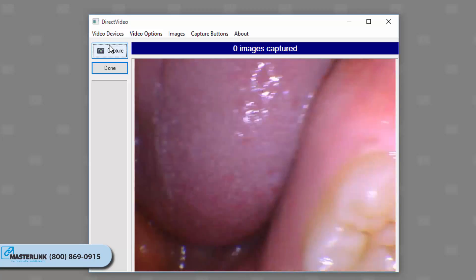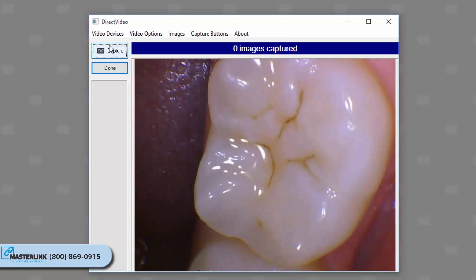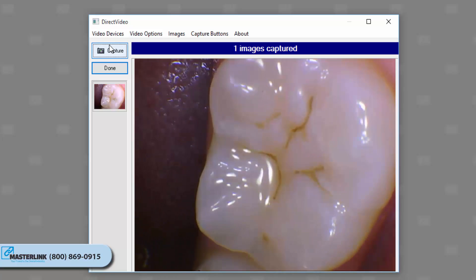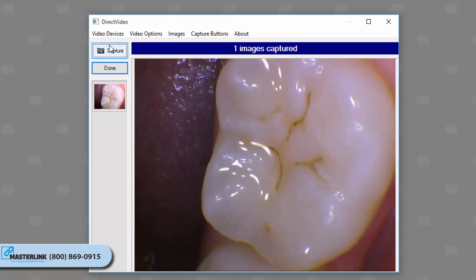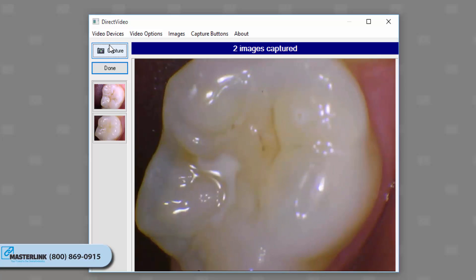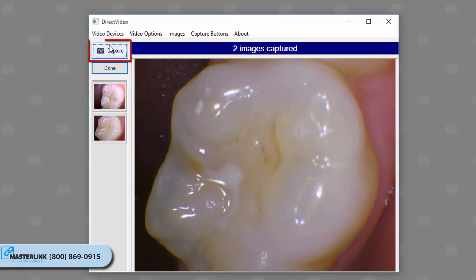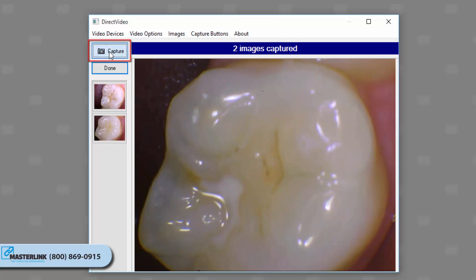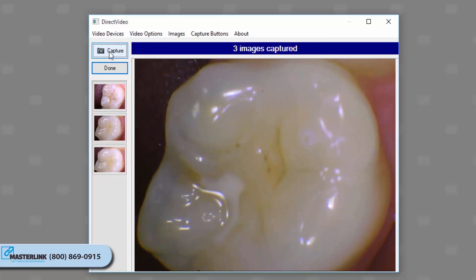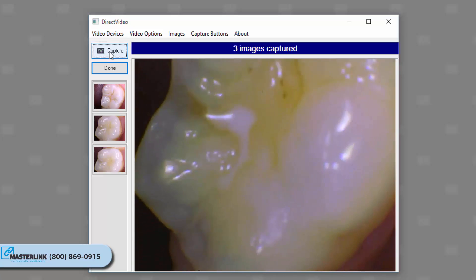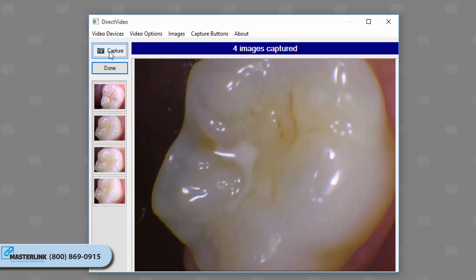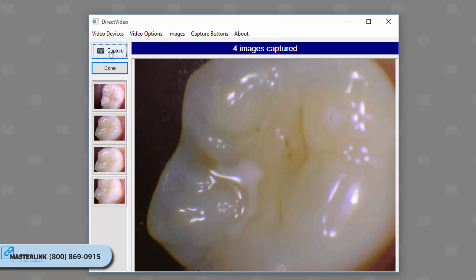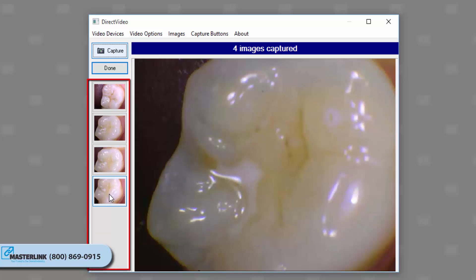Capture the image using one of the following methods: pressing the button on the camera, stepping on the foot pedal if configured, clicking the Capture button in the direct video interface, or press the space bar on the keyboard. Once captured, a thumbnail of the image will appear on the left side of the direct video interface. When finished, click the Done button. Multiple images can be captured at once, if desired. Additional thumbnails will appear below the initial one as images are captured.